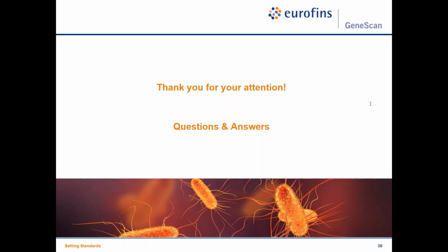Yes, so there's one question that came in now, which is basically the definition, and I know this is always a big confusion, and this is also something that internally we discuss a lot, and you have to be very careful with that: the question between dilution and ratio. So if we talk about a dilution, this is why I try to make it clear. Our dilution is a 1 in 3. So this means you have 375 grams in 750 milliliters of enrichment broth.